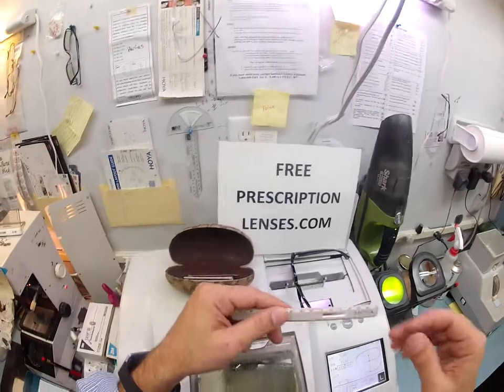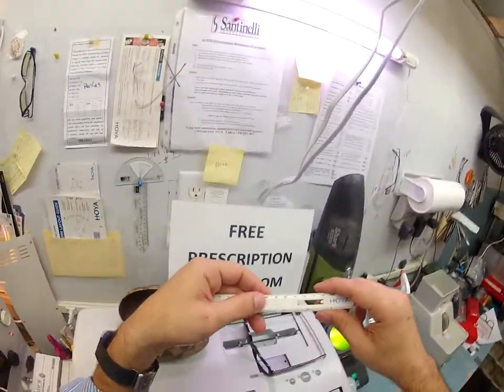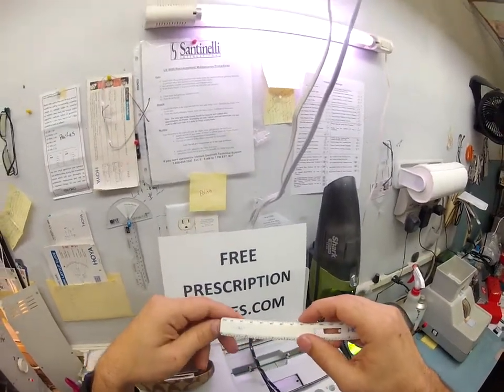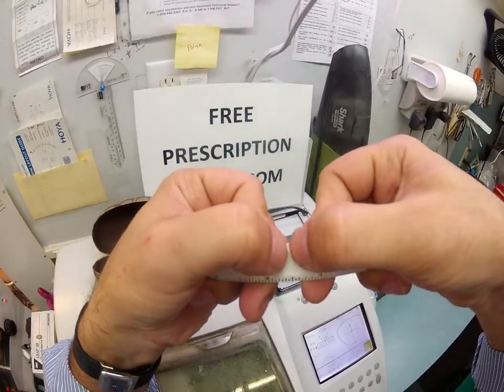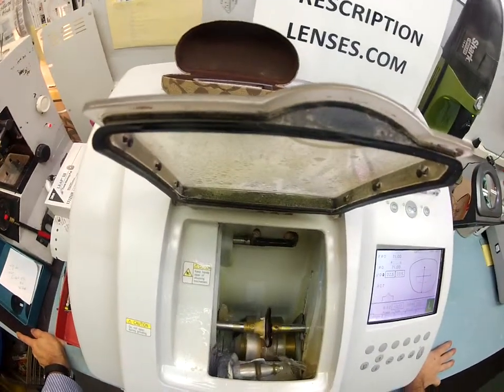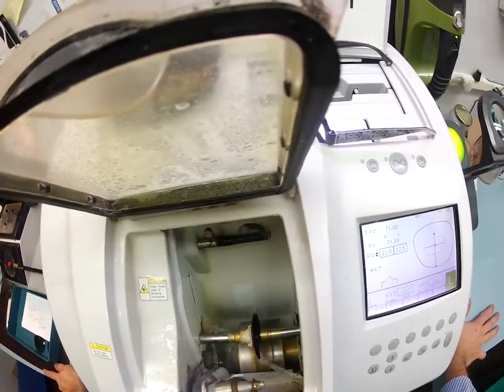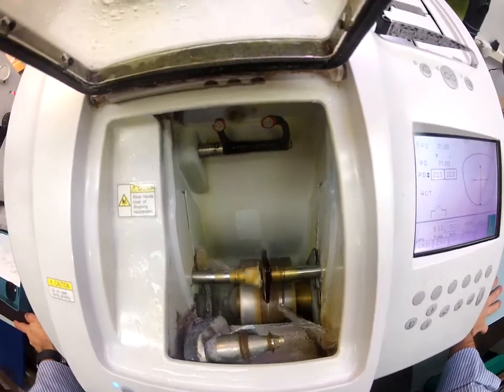1/10 of a millimeter, because I am speaking to Americans. Everyone else around the world knows what a millimeter is. But there's 25.4 millimeters to an inch. There's 2.54 centimeters to an inch. But a millimeter is the distance between my thumbnails. So I'm going to take 1/10 of that off around the circumference of your lens. Round and round.